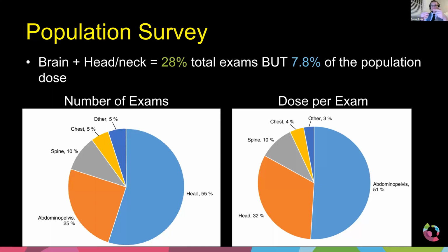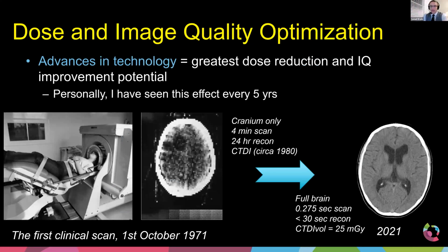That's one type of study. And then the next study is the overall dosing that goes into that. And so it's wonderful that you guys are getting the new technology. You're going to get radiometrics. It's going to be widely distributed throughout Thailand.